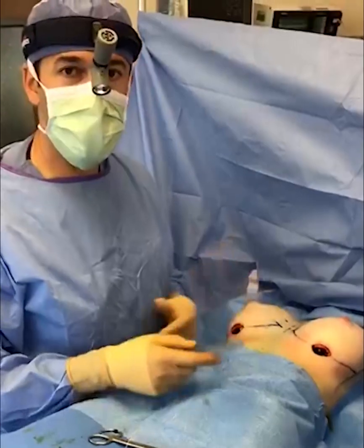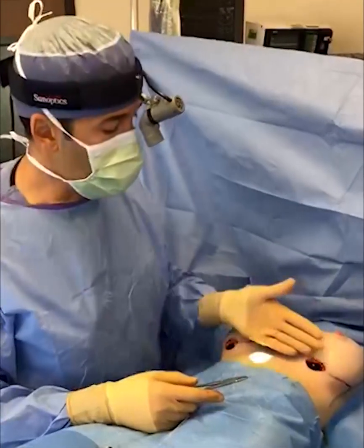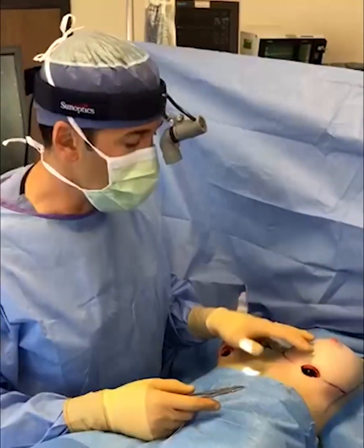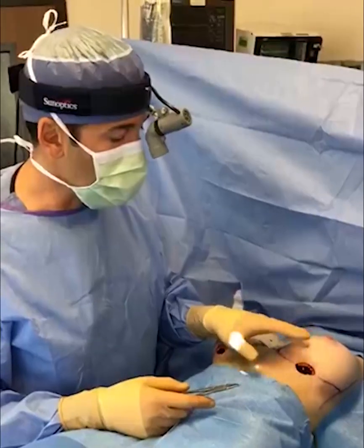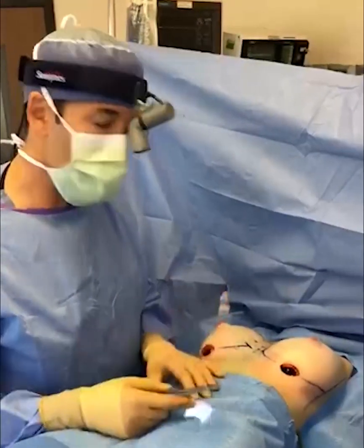All right, so I hope you've enjoyed this part of our surgery. We're pretty much done right now. What we're going to do is close these incisions. I close them in multiple layers, get a real nice tight closure so that the scar heals very nicely. And this pretty much concludes it.